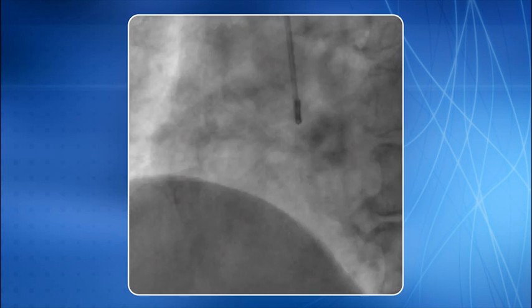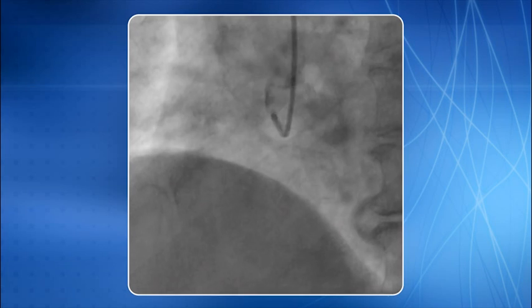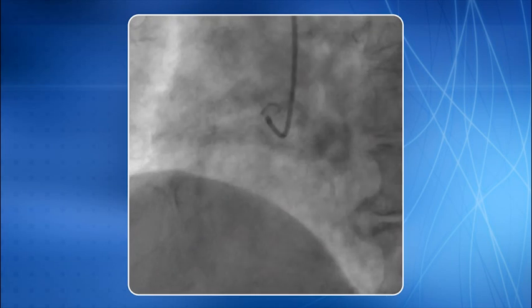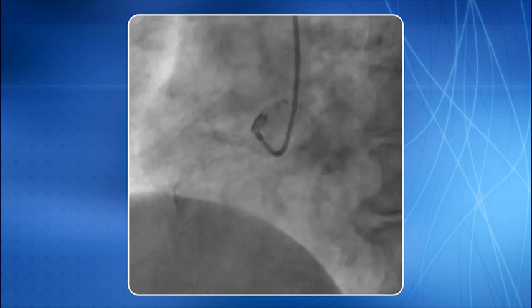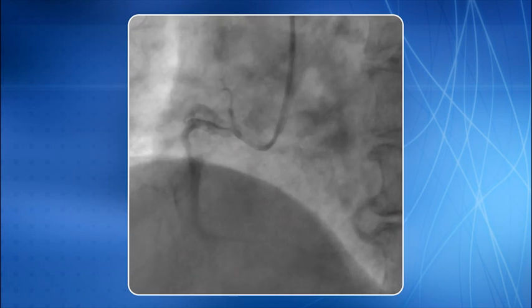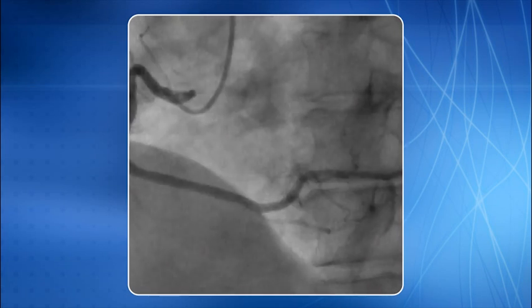I will show you a slightly different technique to cannulate the right coronary artery using the same catheter.